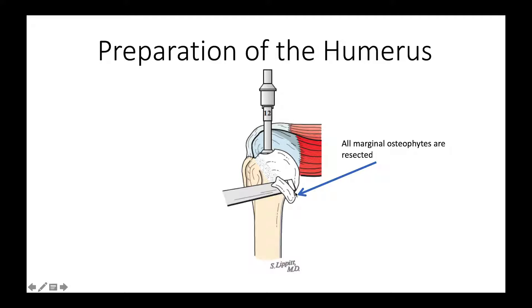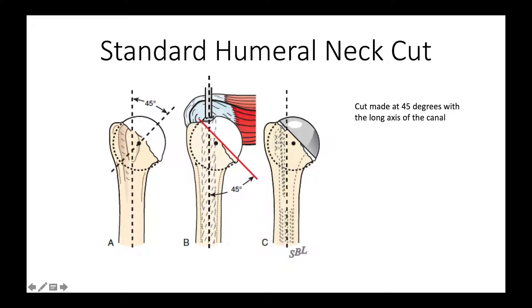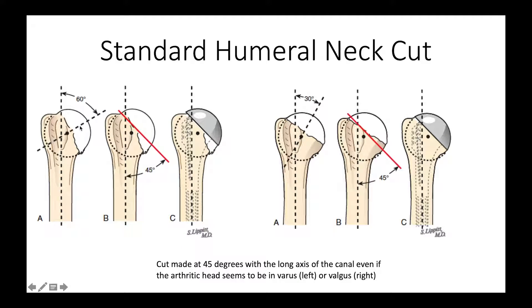As we proceed, we're now going to remove the osteophytes or bone spurs from around the humeral articular surface, and then plan our cut. We like to make that cut in everybody at 45 degrees with the long axis of the shaft. The long axis of the shaft is defined by the reamers that we placed in, and we make the cut at 45 degrees, even irrespective of what the preoperative anatomy is. Some people are concerned about a humerus that looks like it's in varus or in valgus, but we've found that in every situation we can adequately provide a new articular surface with a 45-degree angle cut. Again, the cut is at 45 degrees with the long axis of the shaft, and that long axis is defined by the reamers that we inserted.